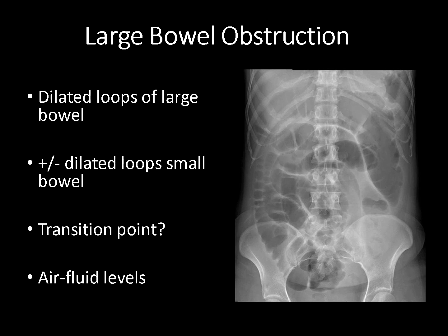Because as you can imagine, if that pressure can't be released backwards up proximally into the small bowel, you're getting a rapid buildup of pressure just in the large bowel, which has less space or fewer bowel loops to allow for that pressure to build up before you start getting ischemia and perforation, and those things that lead to morbidity and mortality to a higher degree in the setting of obstruction.